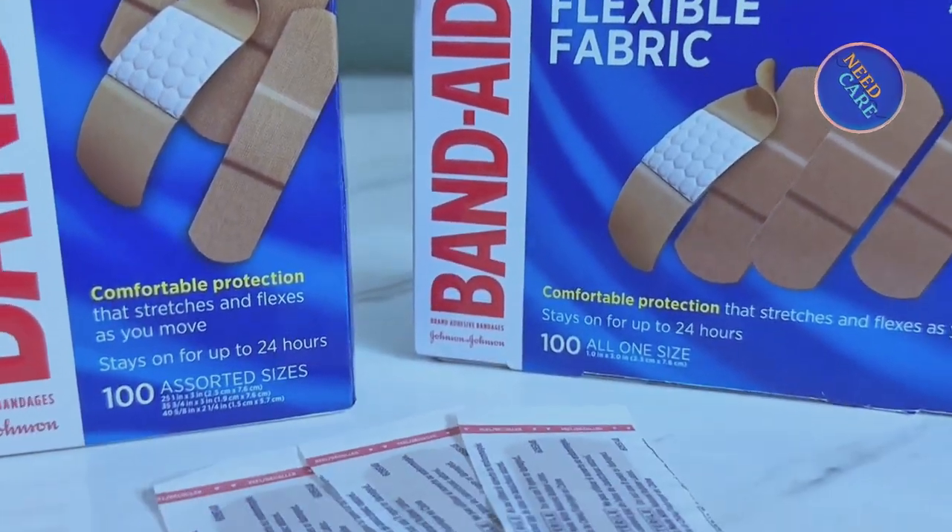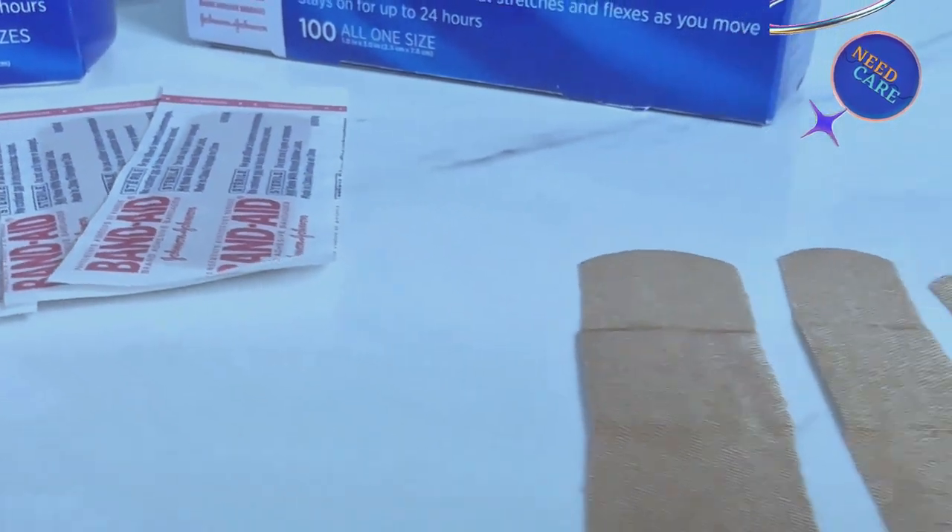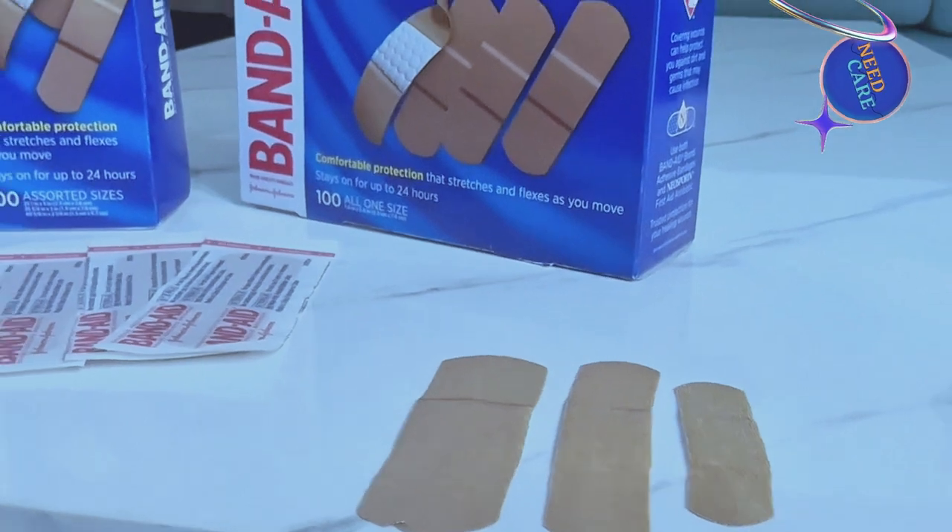Let's see this review. So you had a couple questions about these Band-Aids. Hopefully this video will help you out because I did purchase these and now I'm making a review to help you out. So these are the Band-Aid Flexible Band-Aids — they are flexible fabric and they come in multiple options. I have a couple options I'm going to go over.